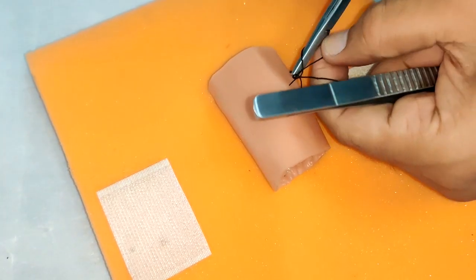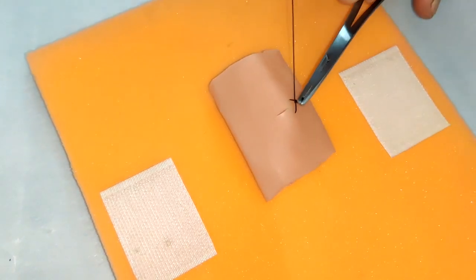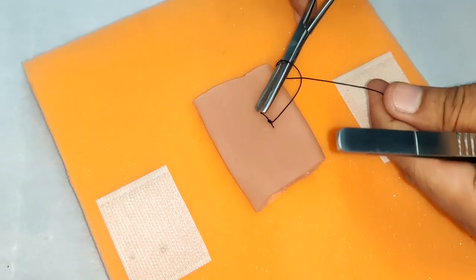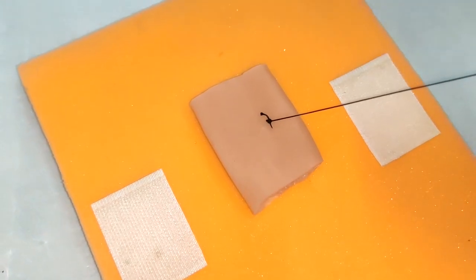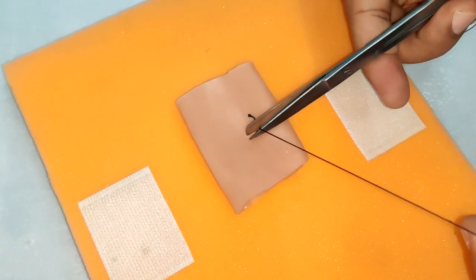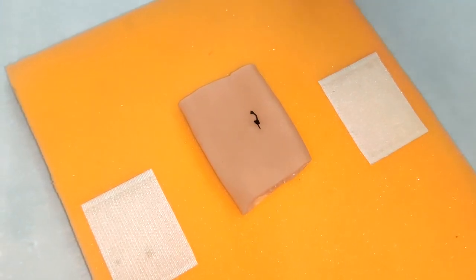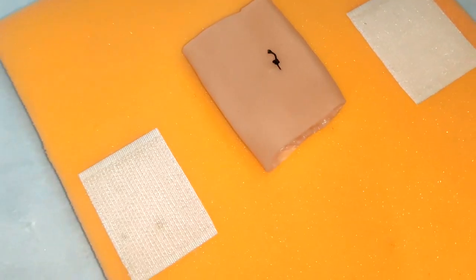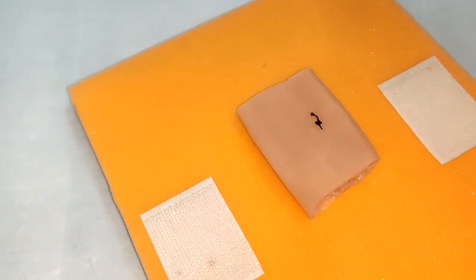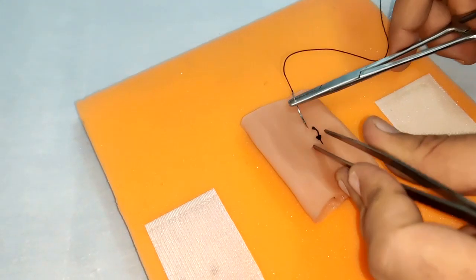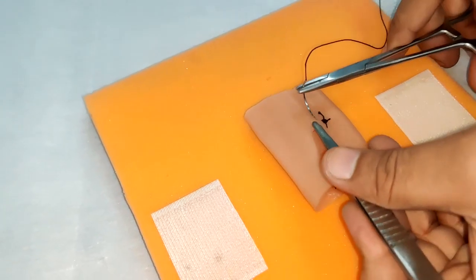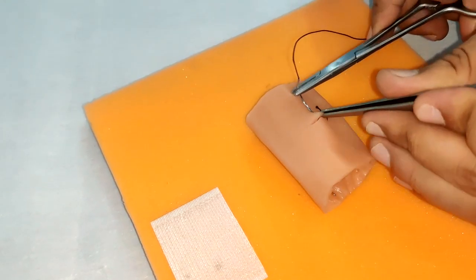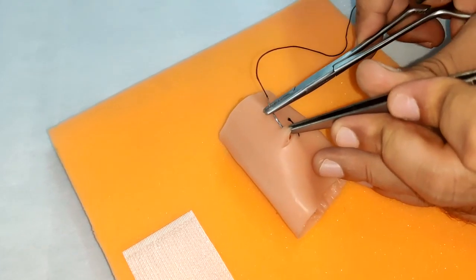We have taken simple interrupted sutures, but you could have also taken continuous interlocking sutures. Again, the maneuver is from outside, we go inside the lumen and come out again.